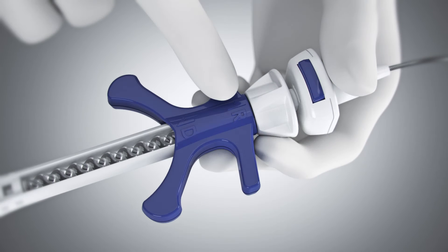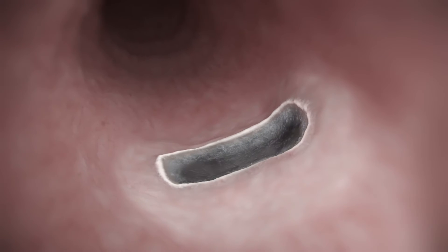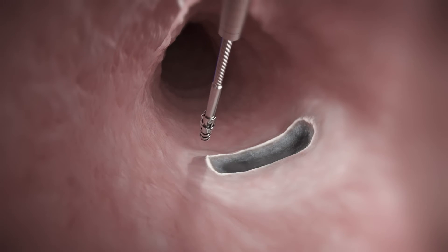Ensure the handle slider is in the reset position labeled R and the push catheter is in the initial locked position. Maneuver the scope to the target site. Recommended helix TAC placement is approximately 5 to 10 mm from the defect margin. Verify position before fully driving into tissue.